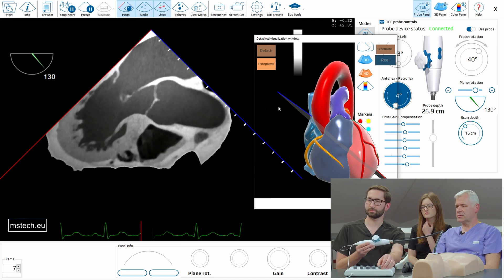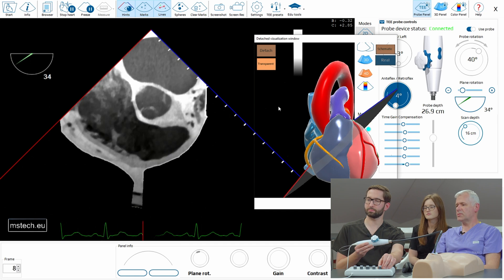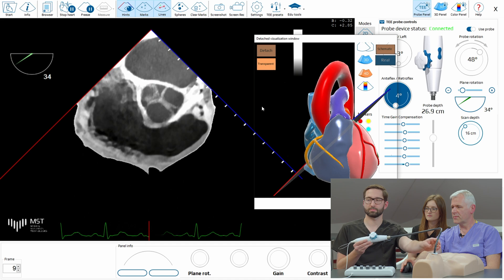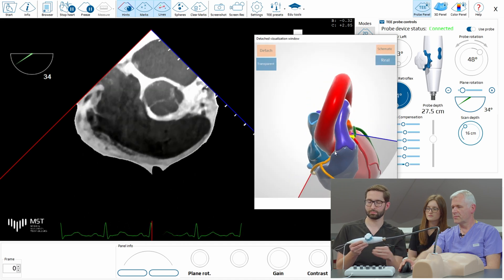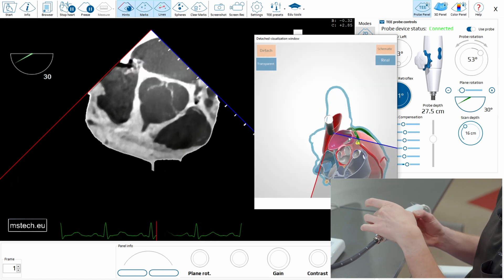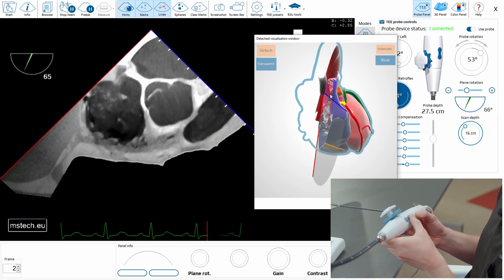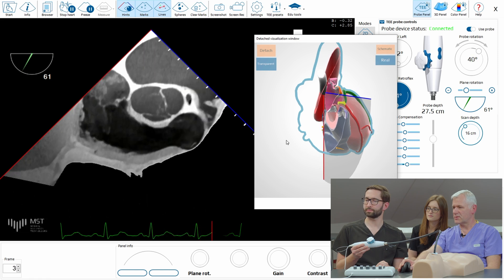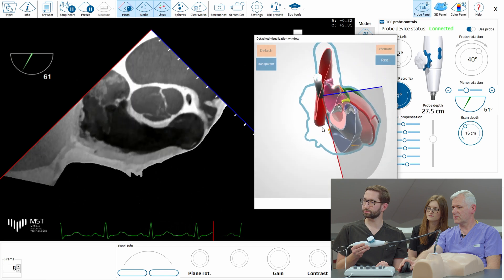Come back to 30. Show me the inflow-outflow view. Do you remember how we did it? You just have to increase the angle to approximately 60. And you see inflow-outflow — very easy. You can see it here: inflow-outflow.